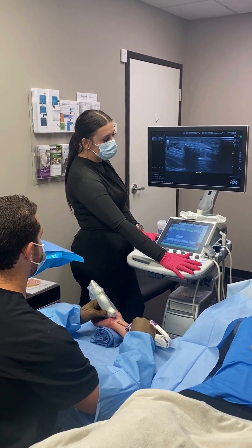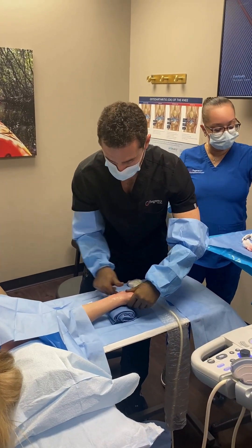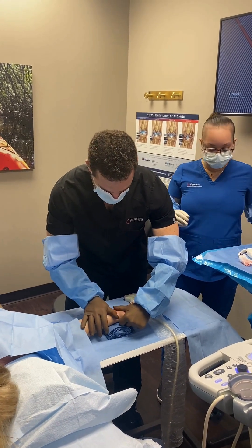After the transverse carpal ligament is cut we simply remove the device and wash the area out with some saline and apply a dressing.